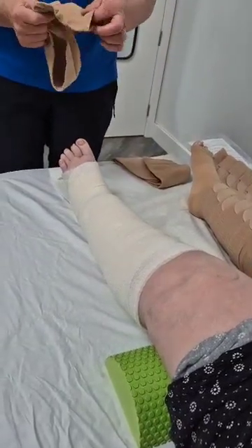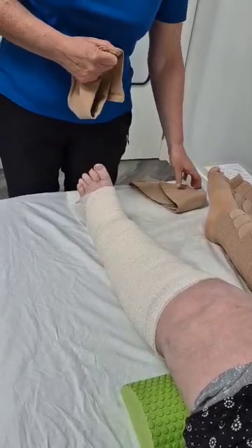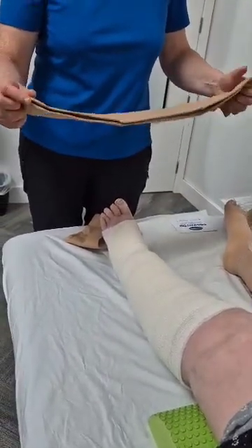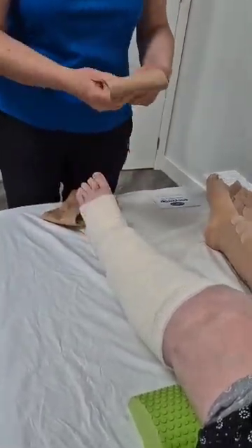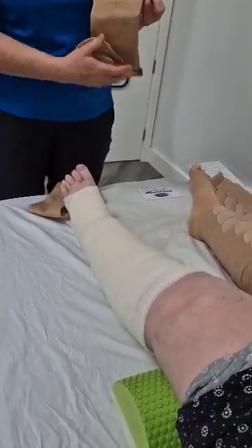One of them has compression in the foot, and this is the one that we are going to use. There is another liner that has no compression in the foot. I don't think we're going to use that, but Jenny has them, and we will have them as an option in the event that we have any sort of foot issues. Okay, but for the time being, we're just going to leave them to one side.